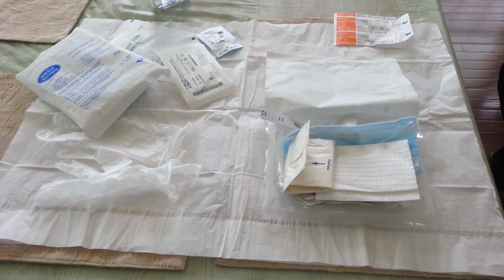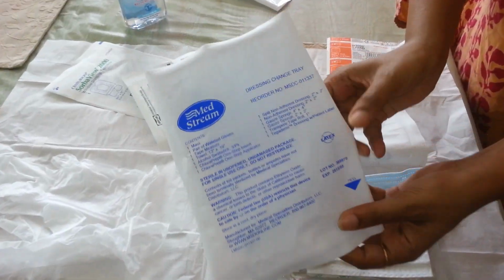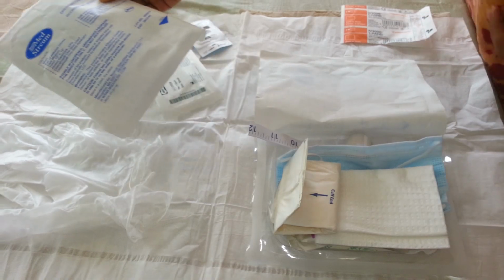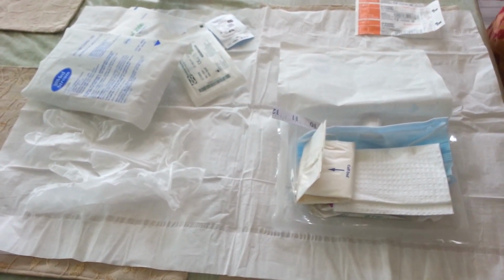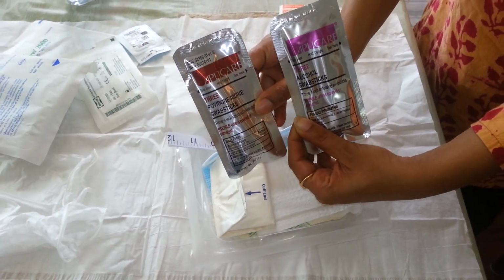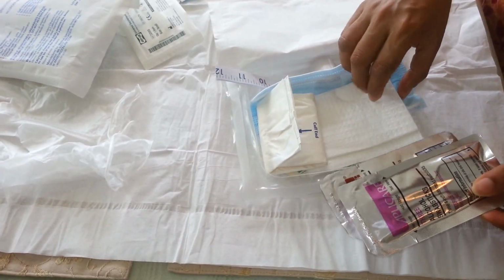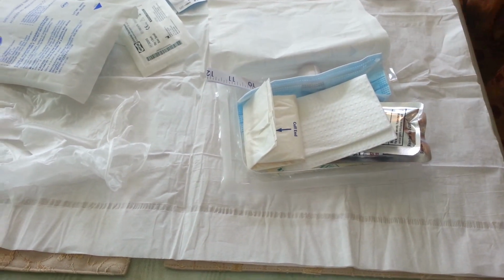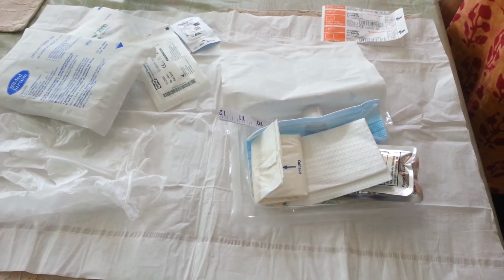This is the dressing change kit I use. It is the Medstream brand. Before this, I have used 2 or 3 other brands, most of which have similar contents. Only difference is that some contain alcohol swab sticks, some have betadine, and some have chloroprep with or without alcohol swab sticks. I prefer the kit that contains both alcohol and chloroprep. People who are sensitive to these can also use betadine kit. Most of the other items are common.